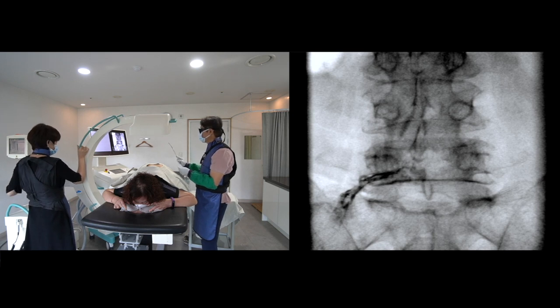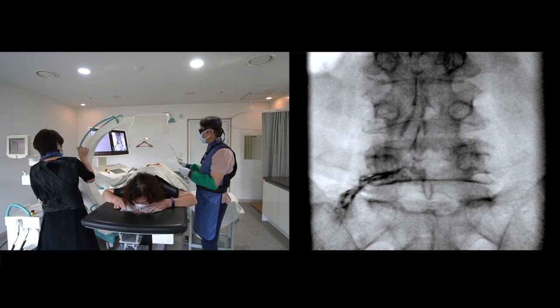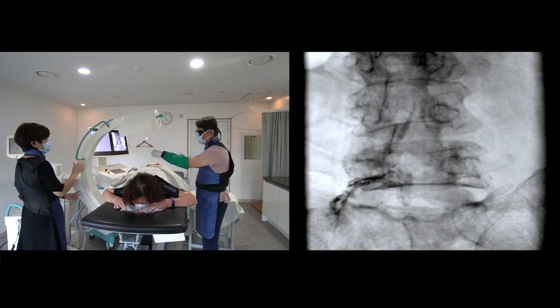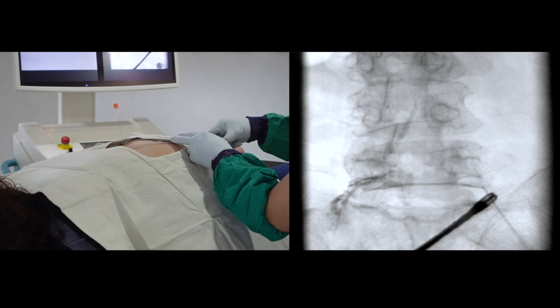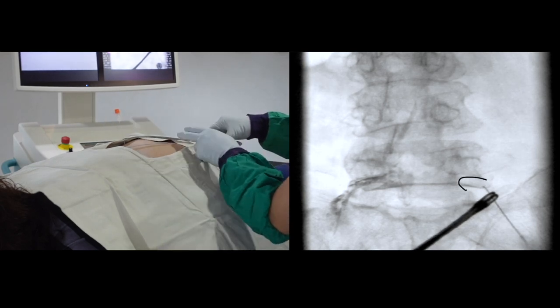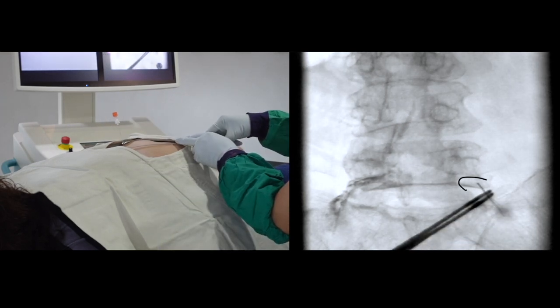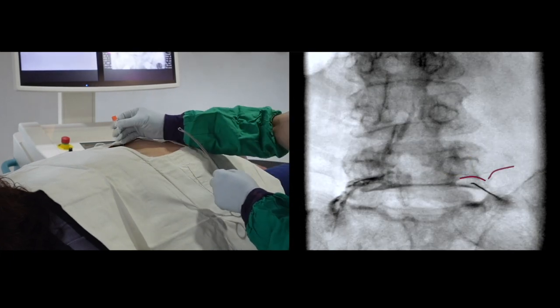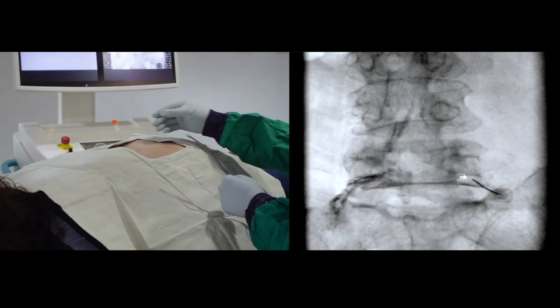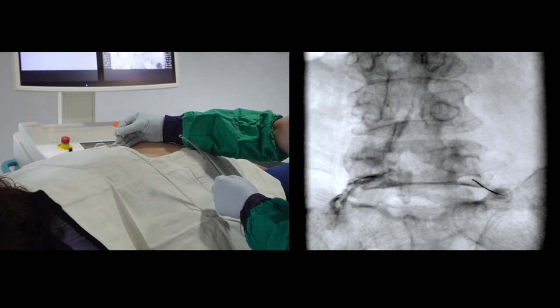The right approach is more challenging than the left one. Turning to the right lateral oblique view — the inferior border of the transverse process is placed caudal to the line of the pedicle, with downward protrusion of the transverse process. I can't go directly into the target point with a standard technique. I need to place the needle more inferior and lateral from the usual target point.